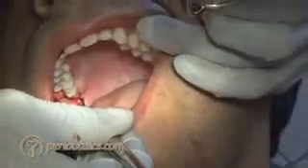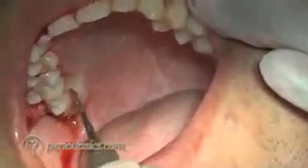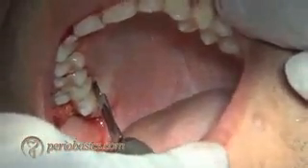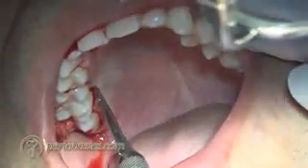And then we go on to the palatal side and we start the first incision, the internal bevel incision. In the same way as we put it on the buccal side, we put this incision on the palatal side.